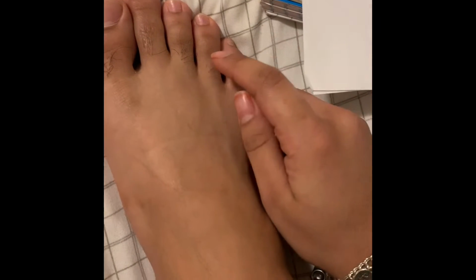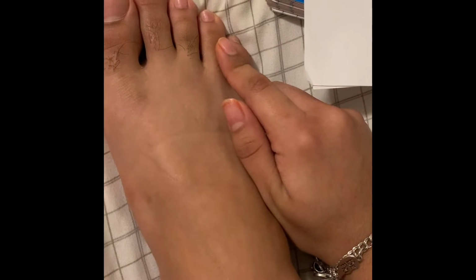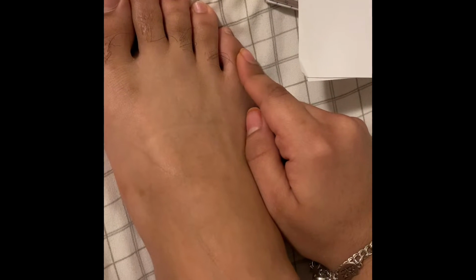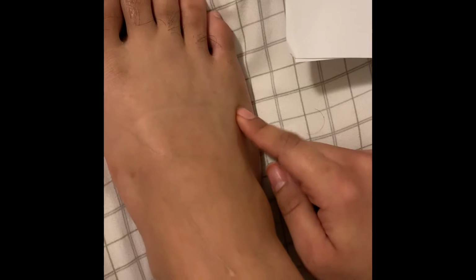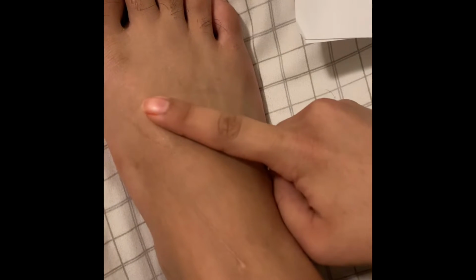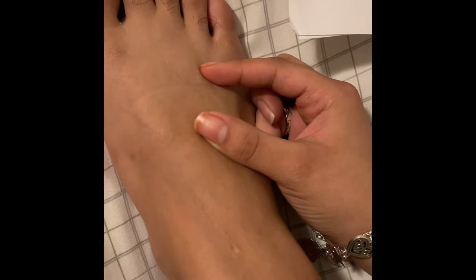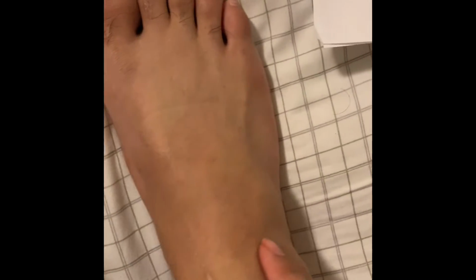And then on the left, we have the proximal phalanx of the fifth digit of the right foot, and then the fifth metatarsophalangeal joint of the right foot. And then down here, we have the tuberosity of the fifth metatarsal. And as you can see on this little part right here that I'm pointing to, that's the cuboid. And then the cuneiform, which is right here. And then lastly, we have the biggest bone on the foot down here, which is the calcaneus.